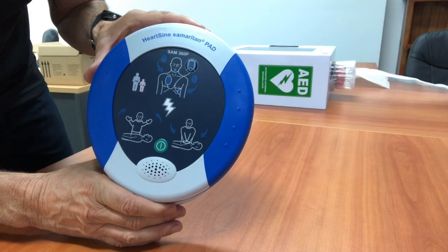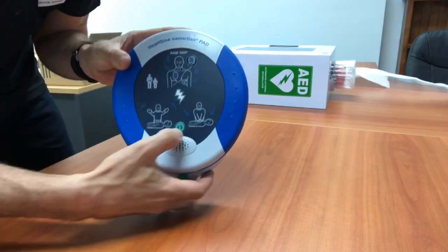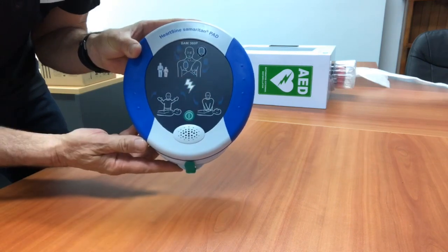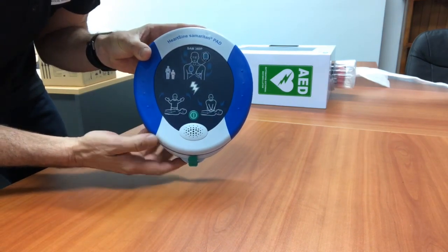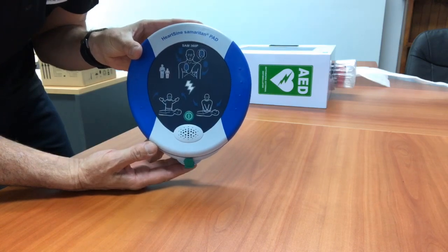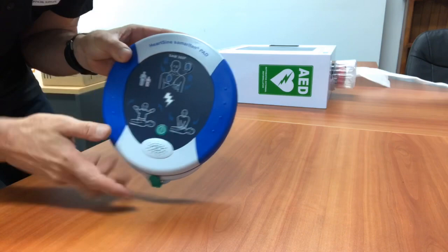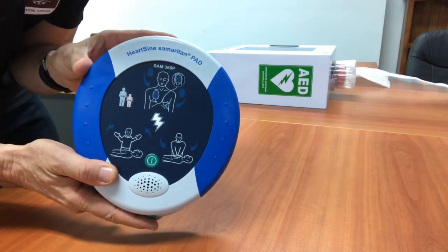The device will now have a green light flashing. We recommend turning the device on and then off to make sure it is in good working order. It can then go back into the case, with the green light flashing every 10 seconds.